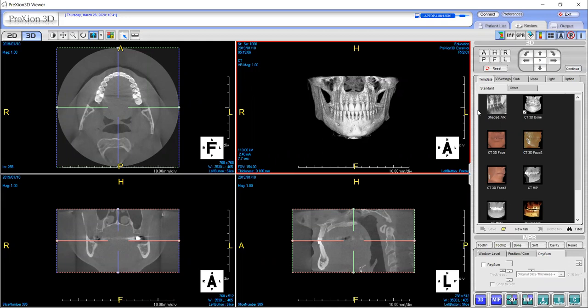Let's start off by manipulating our crossbars. It is very important that when analyzing a specific site, we make sure that our crossbars are always located at the center of that specific site.